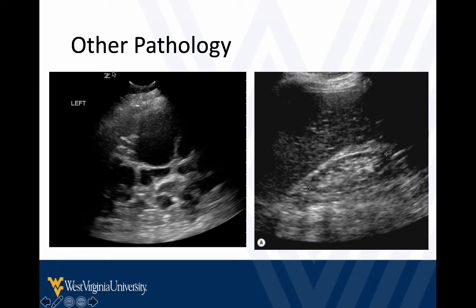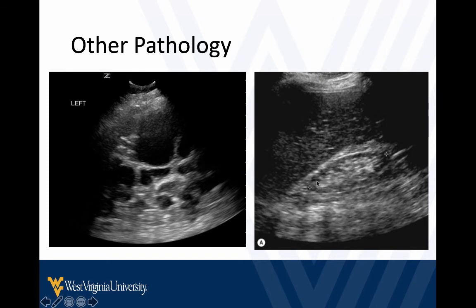You may see polycystic kidney disease — there are occasions where you may be the first person to diagnose that in the patient. You'll see the whole kidney obliterated with multiple cysts everywhere. Sometimes it can be hard to tell if there's obstruction because this obscures the anatomy. You may also see renal atrophy. In patients with long-standing kidney disease, you may have a really hard time finding their kidneys. Here's an example where the kidney is small and the cortex is very thin — this is an atrophied kidney.